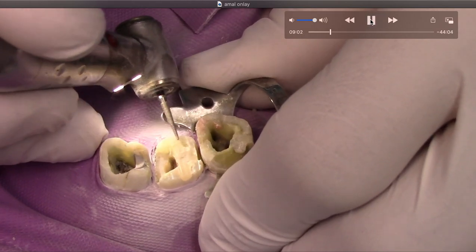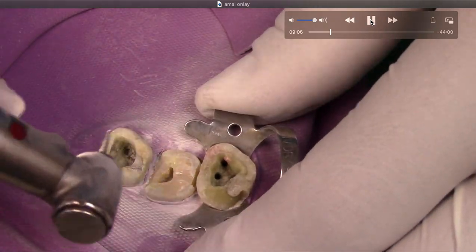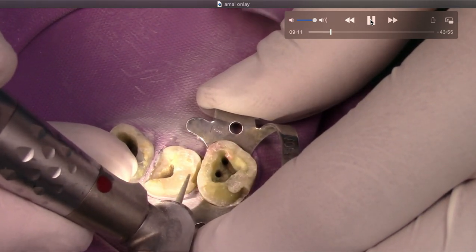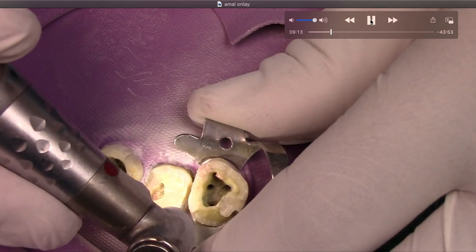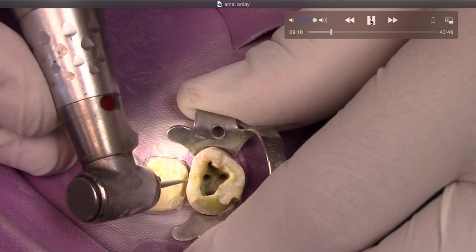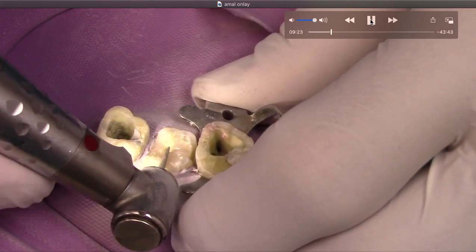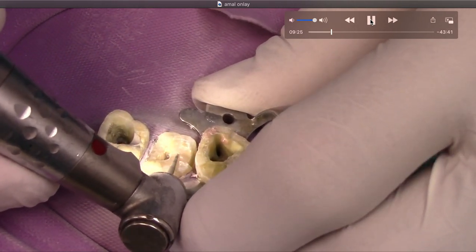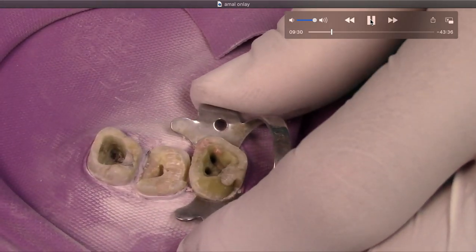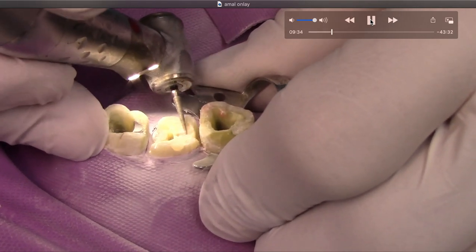Anything that's going to act as a point of stress concentration when we carve amalgam, you really want to get rid of it. It's actually been about a month since I filmed this. I'm redoing the voiceover because I was in isolation with a man cold — fortunately not coronavirus, just a head cold my kids gave me — so I'm watching this again for the fourth time but the first time in a while.